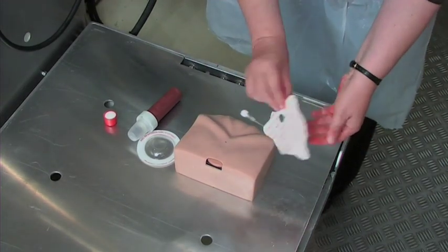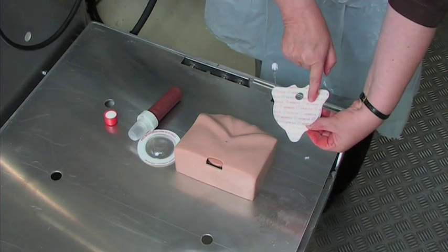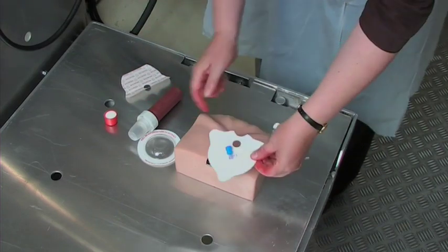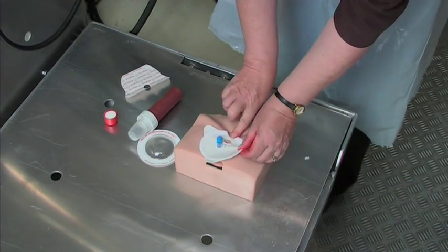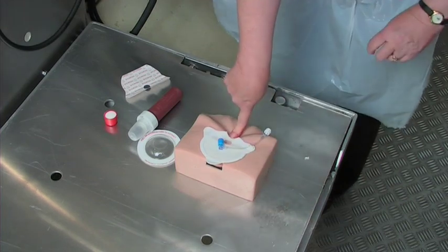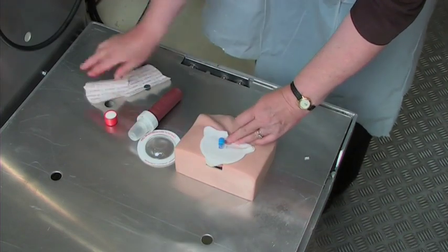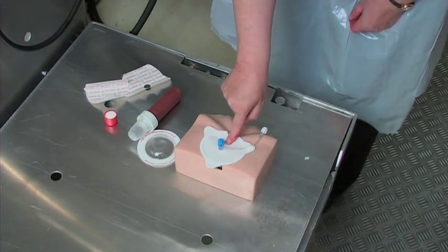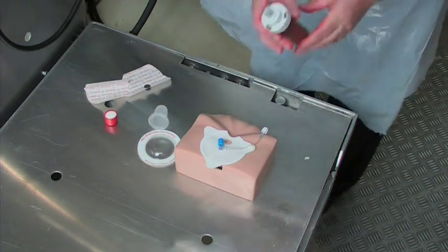You take the target patch, and when you turn it over, it clearly says remove 1. So peel off the backing and put your finger into the sternal notch and make sure that the curve of the target patch is at your finger. Then lift it up and remove the second part. We now clearly have this space here, which is where we need to apply the gun.